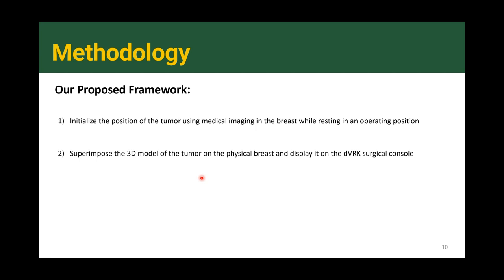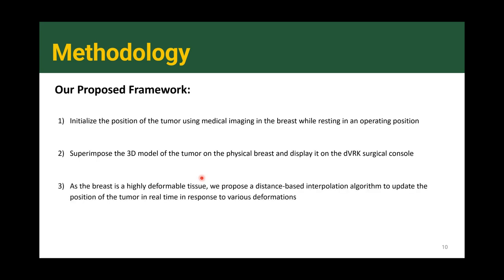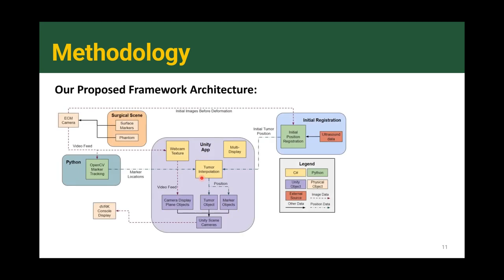And finally, and more importantly, because the breast is highly deformable, as a response to different forces and different movements of the breast, and while the patient is lying down, there will be deformations to the breast which lead to the movement of the tumor. So we also propose a distance-based interpolation algorithm to update the position of the tumor in real time to these deformations. So the architecture is seen as follows.